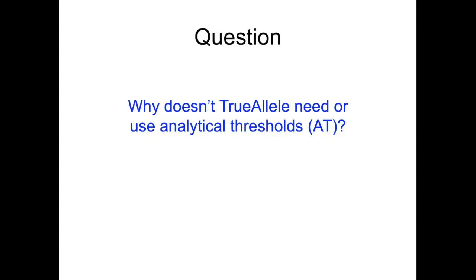This is a preparatory question for what you're about to see next. Why doesn't TrueAllele need or use analytical thresholds, AT? This is a question we get asked all the time, and let's answer it. Next.